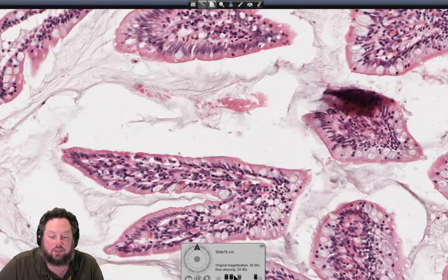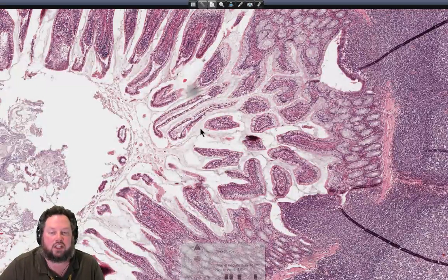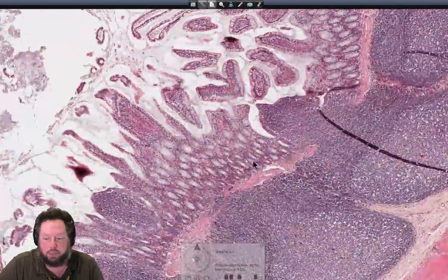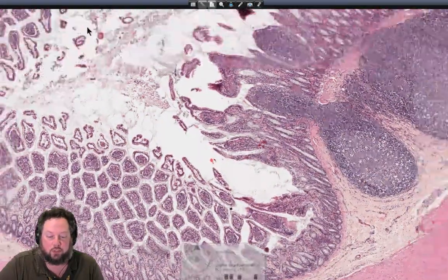So again, their villi look very similar to the other villi. I mean, histologically, they say you can distinguish between the different regions, but I certainly don't expect you to be able to do that. It depends on who's teaching you histology, I suppose.